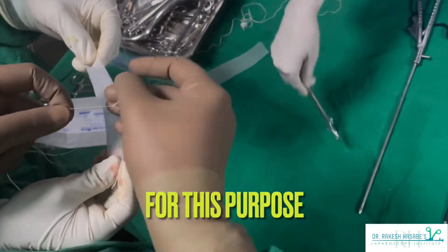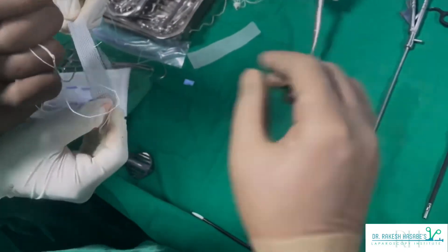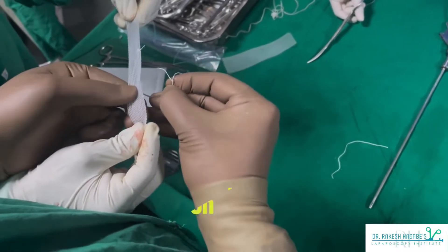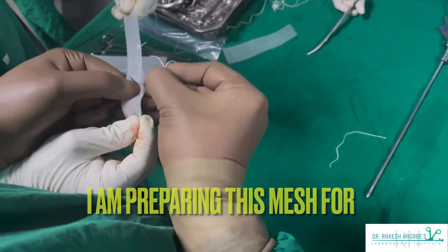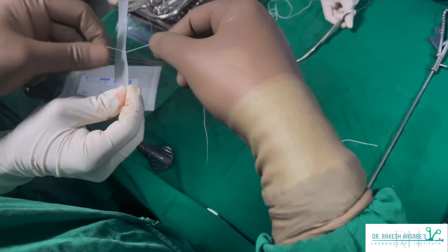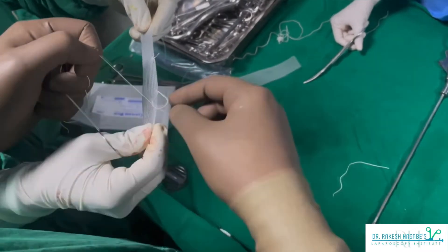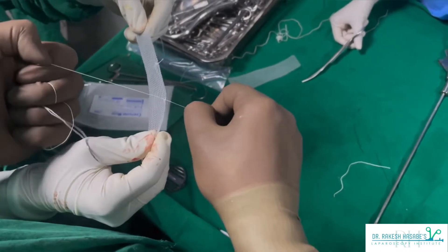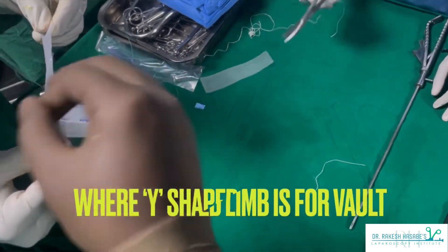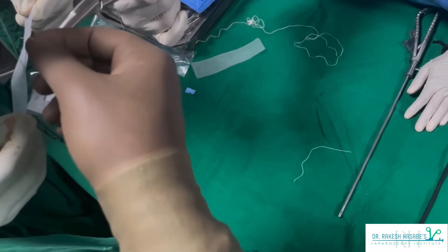For performing laparoscopic sacrocolpopexy, I will tie one end of the mesh to the sacral promontory, and the other end — which I have divided into two anterior and posterior sleeves — will be stitched to the vault. The anterior sleeve will anchor the anterior part of the vault after pushing the bladder attachment down, and similarly the posterior sleeve will anchor the vault posteriorly after raising the peritoneal flap from the posterior part of the vault.